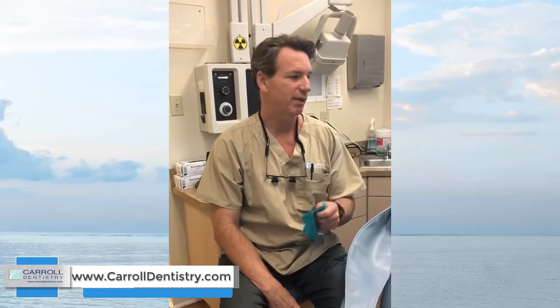Thank you for following Carroll Dentistry and tuning in for this tip of the week. This tip is about rubber dam and isolation — one of the key factors of good bonded dentistry, whether it's BioClear or any kind of dentistry.